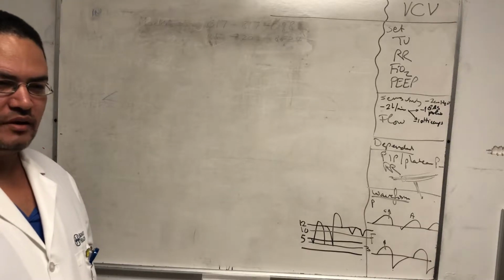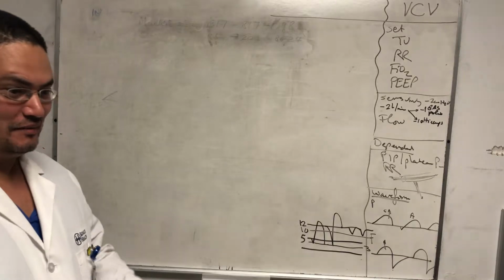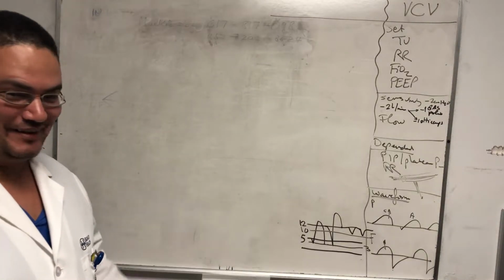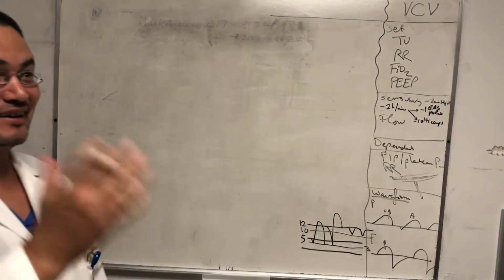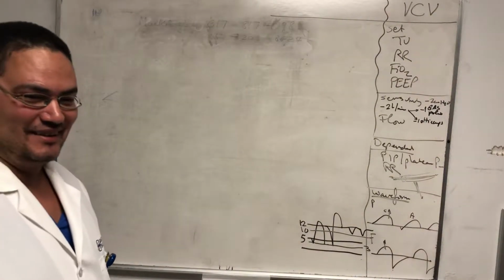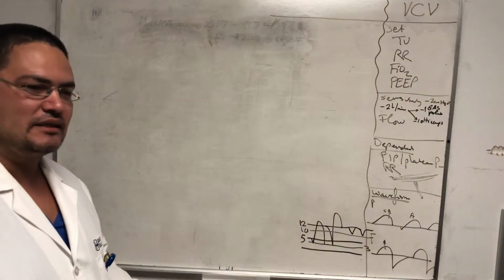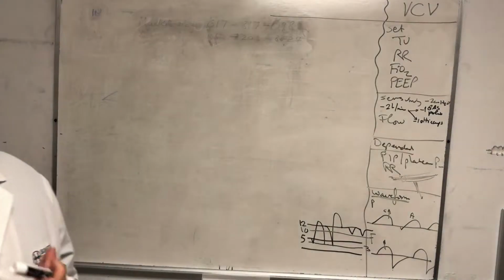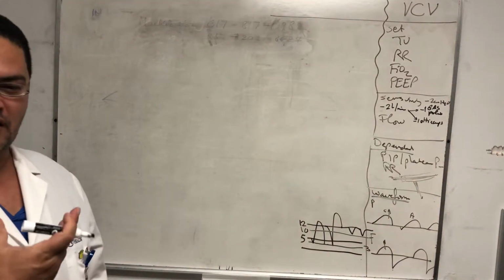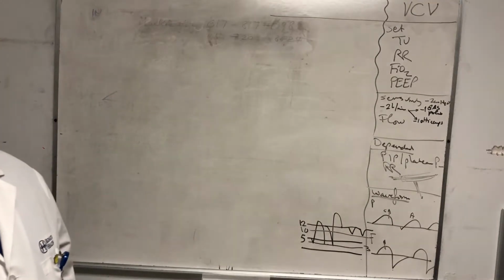So we go in the room, and I was puzzled. What's going on? I was scared because I could see my career disappearing in front of us. The Boston Globe is going to put out a miracle in the South. Anyway, we look and we find that that's exactly his heart rate. He was thin, and his heart was beating so hard that it actually changes the pressure inside his chest, and so we went to -10.